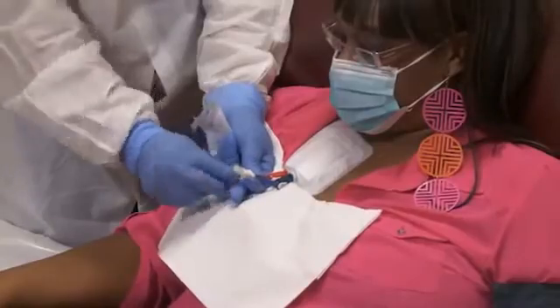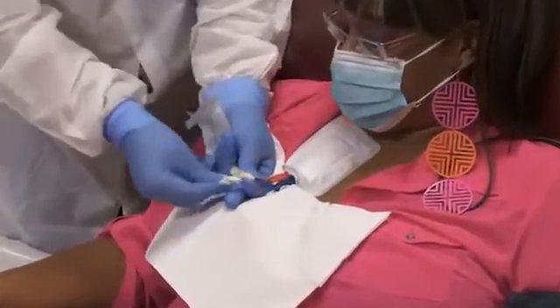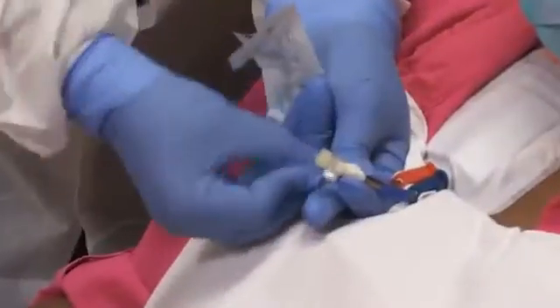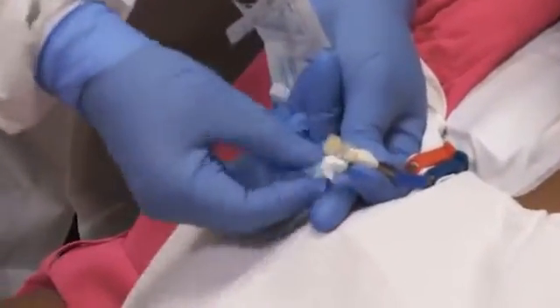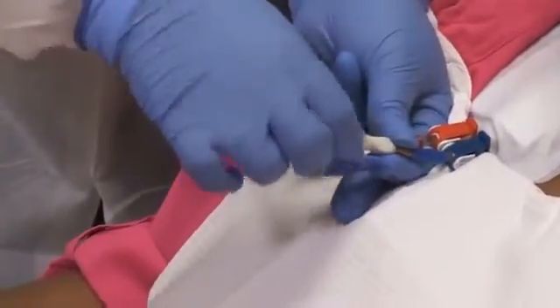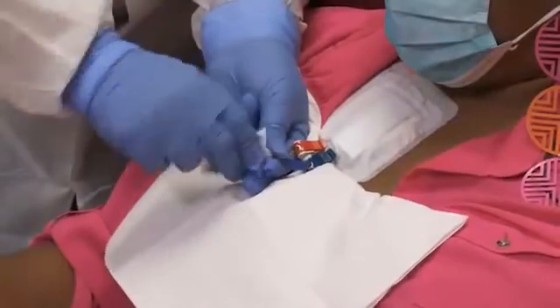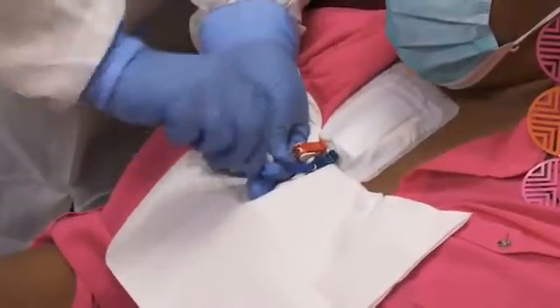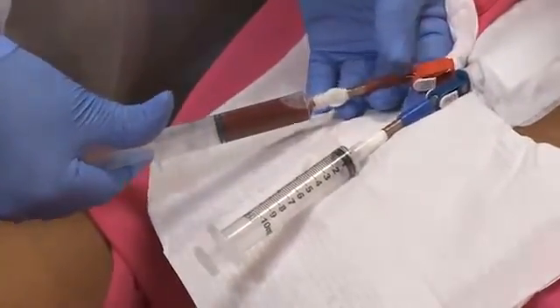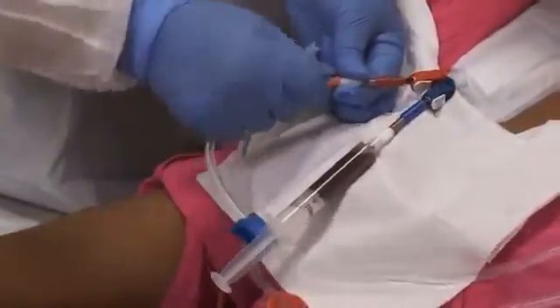Remove the caps. While keeping the catheter clamped, apply antiseptic to each end of the catheter, which are the hubs, using a new sterile antiseptic pad for each hub. Scrub the end and sides of each hub with friction, ensuring that all debris is removed. To maintain aseptic technique, let the catheter limbs and hubs air dry naturally. Do not touch the cleaned hubs and do not set the hubs down.